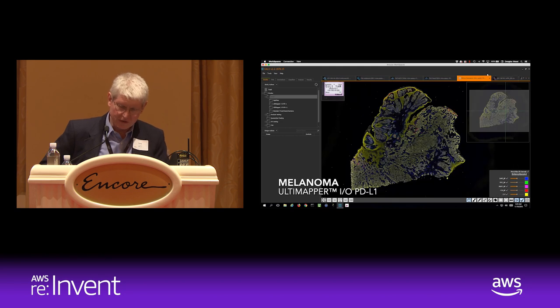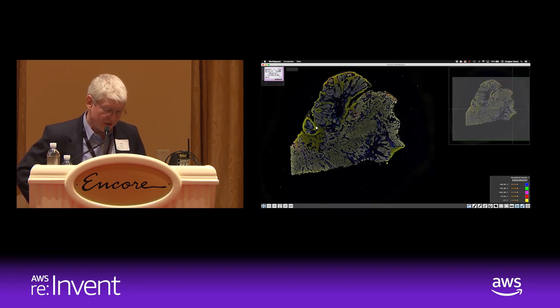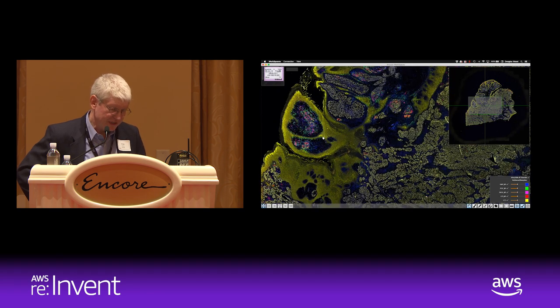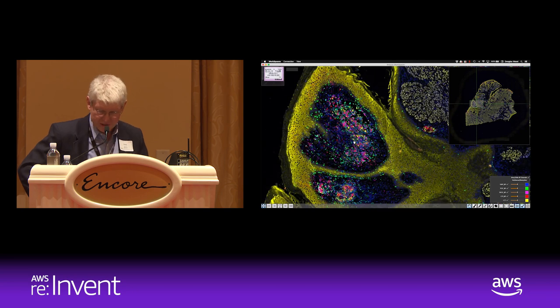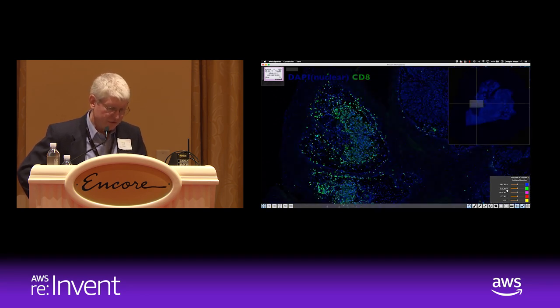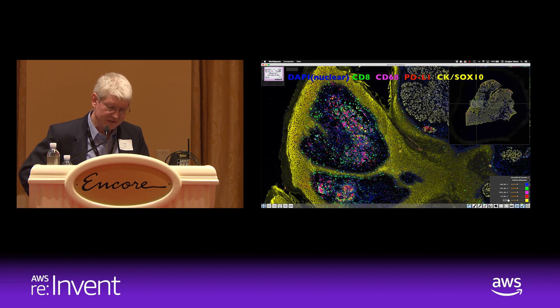And we're now going to take a look at that example that Jackie showed. This is a melanoma tumor example. And we're going to switch to full screen mode and zoom in here on the tumor region, and we'll also show the different channels here. I'm going to turn off all but the DAPI nuclear stain. So this blue first shows you where the cell nuclei are, then a marker for immune cells, and as we go on here, we see markers for the cancer, and as we see the cytokeratin SOX10 as well.